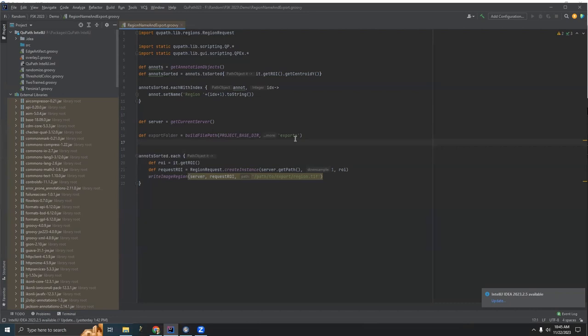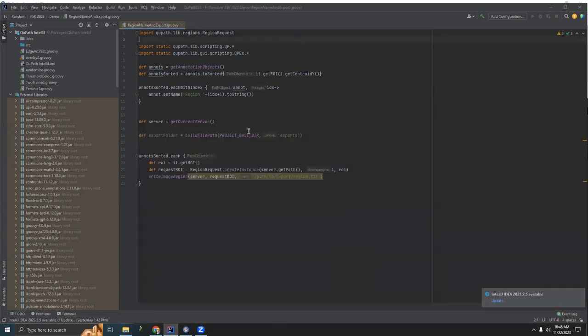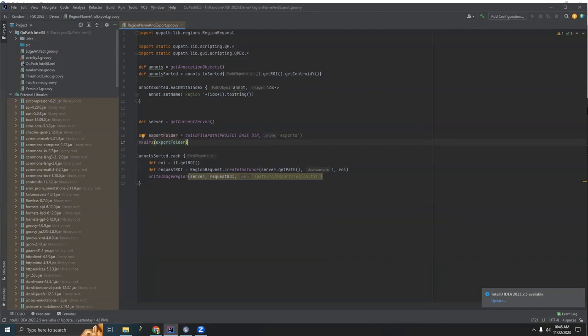This exports folder does not yet exist, so we're going to have to create it, which I could just right now make the folder, but I like to do that based on scripting. That way I can reuse this script in a different project without having to remember to manually make the folder. And that command is make directories, or mkdirs, and you just call export folder. This will make the folder if it does not yet exist, but if it already exists, it doesn't do anything, and it'll just move on. So you don't have to worry about it accidentally deleting data. So that's the overall folder, but we still need to give every file an individual name.